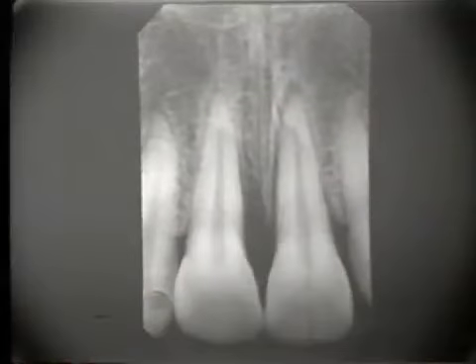All right, next we'll go to a radiograph of the maxillary centrals. On this radiograph, we want to show the 2 maxillary centrals, and we will try to open the contact between the 2. Perhaps the distal surfaces of the teeth will not show, but that's of small importance, for we'll show those surfaces on the next radiograph. There is a small amount of border showing beneath the incisal edges of the teeth.